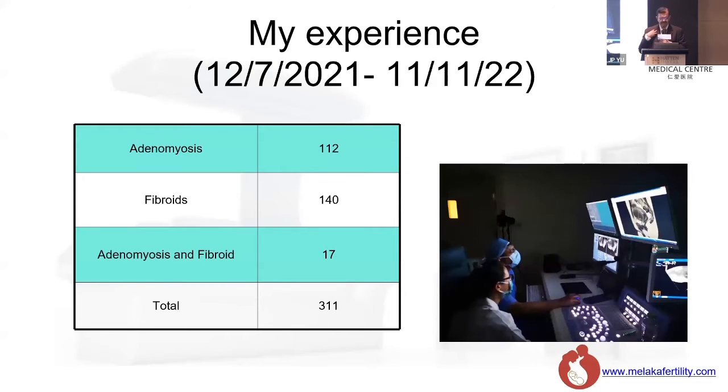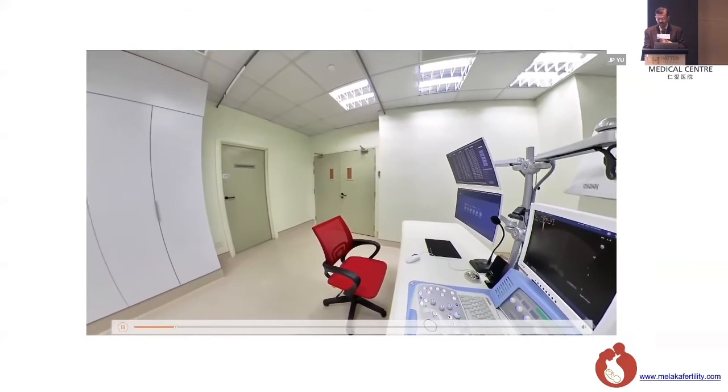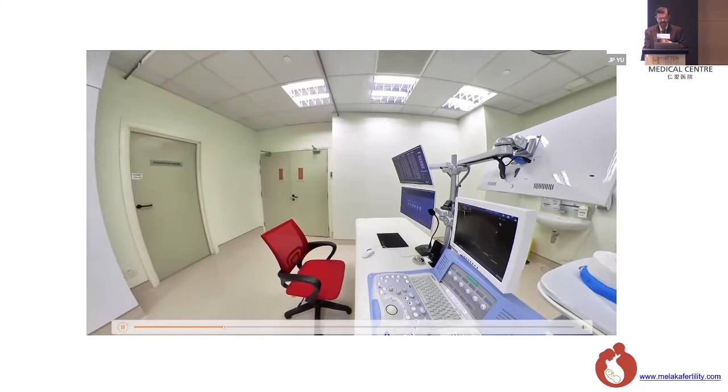Now, what is my experience? I've been doing this for about the last 16 months, and I've done 311 cases, out of which about 112 are adenomyosis, and the remaining are fibroids and fibroid with adenomyosis. So I'm basing my talk on this experience of performing HIFU for adenomyosis patients. Now, you will be seeing this center tomorrow during the tour. It's a small room with the JC200 machine.